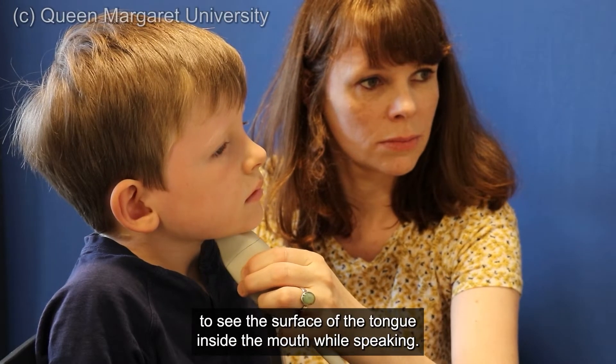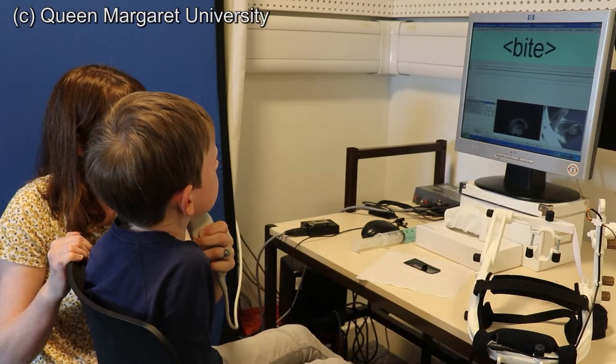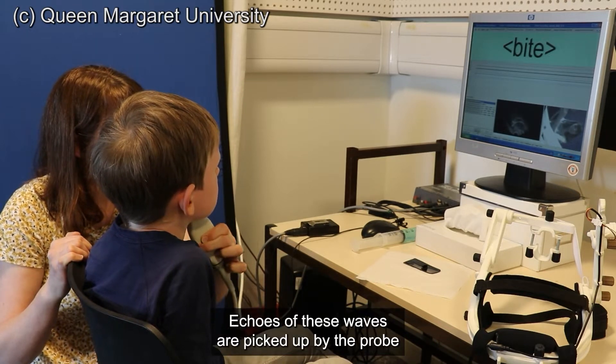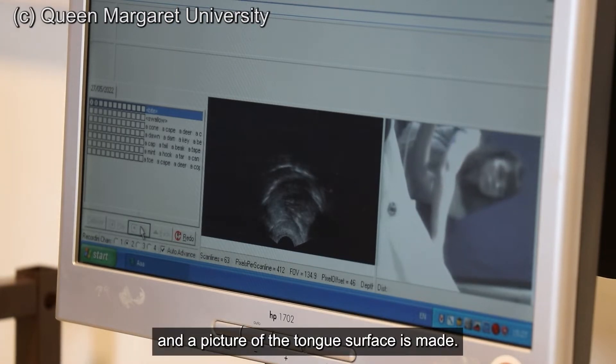Ultrasound tongue imaging allows you to see the surface of the tongue inside the mouth while speaking. The ultrasound probe sends sound waves into the body. Echoes of these waves are picked up by the probe and a picture of the tongue's surface is made.